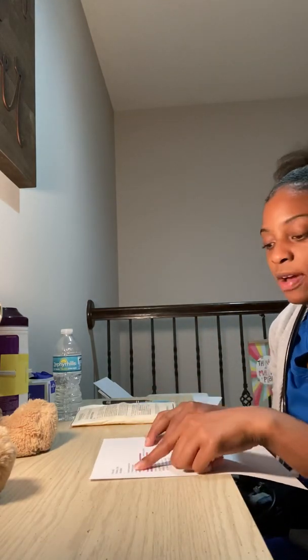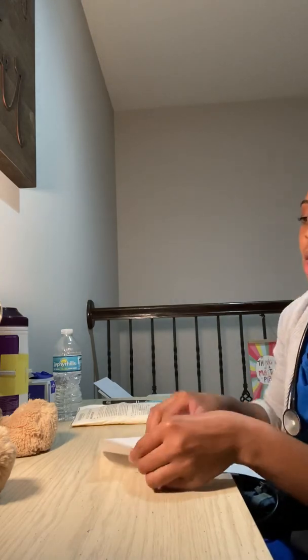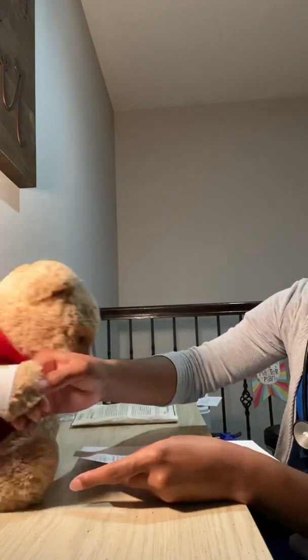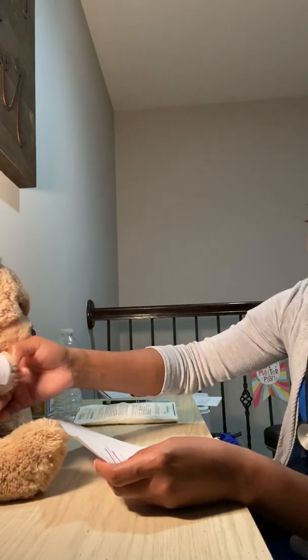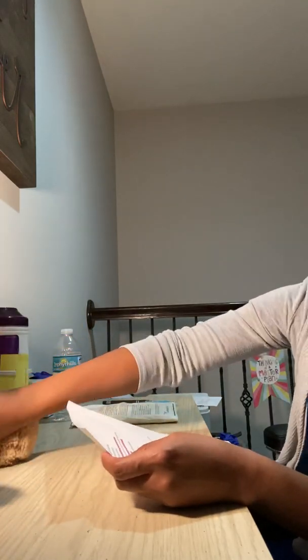I'm going to identify my patient, matching her name on her identification bracelet, which she has on, Miss Sally Smith, to my doctor's order, stating a 26-year-old female with a date of birth of 2/2/94. I've got the correct patient, I've got my order, so I can proceed to go ahead and begin to suction my patient.